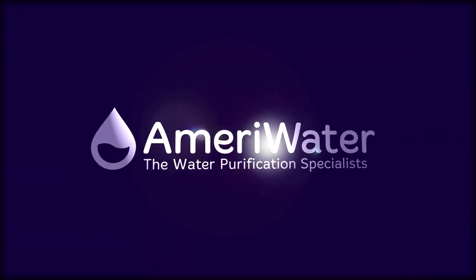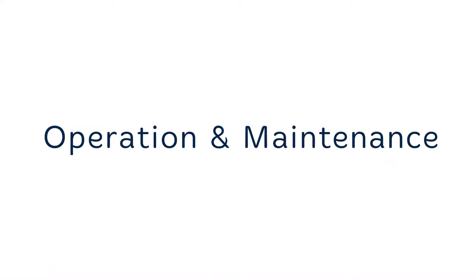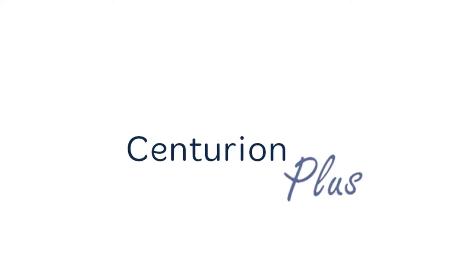Thank you for relying on AmeriWater for your water purification needs. In this video, we will cover the basic operation and maintenance of the Centurion, Centurion Cart, and Centurion Plus models.